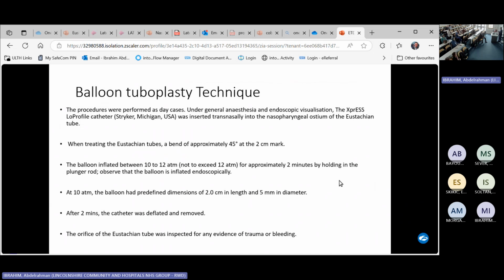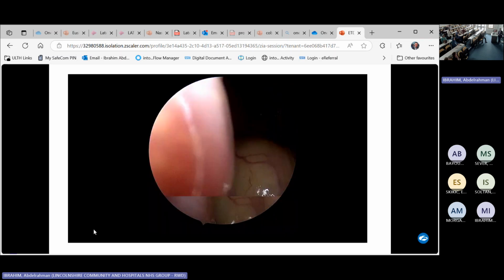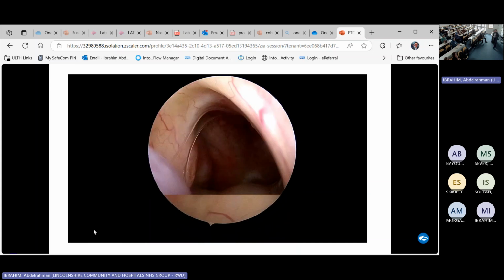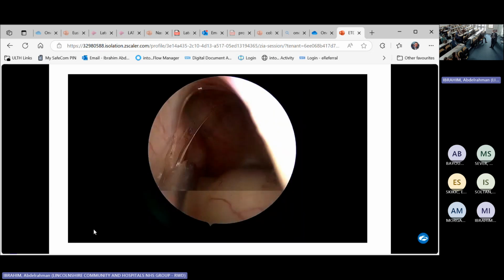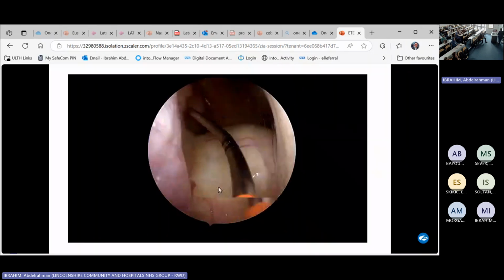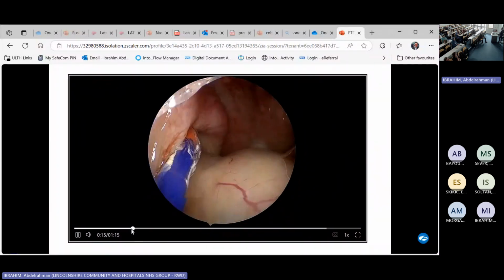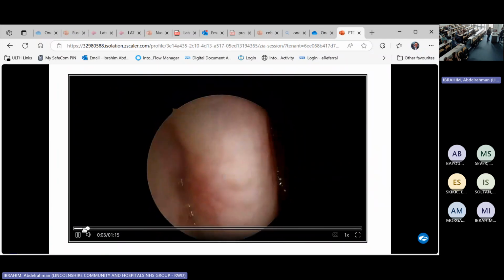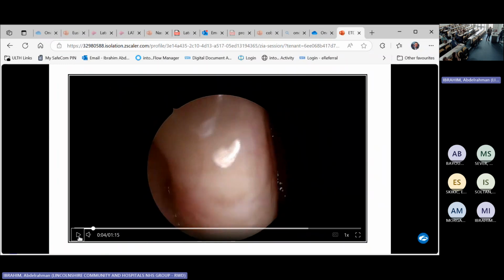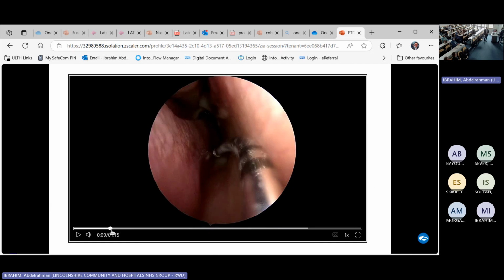So I'm going to explain on a video how we do that. Basically I do an outfracture of the inferior turbinate. Okay, I use the guide. Here it is, give me 1 second. Yeah, that's nice, but I want to show something important that I tell my trainees about.